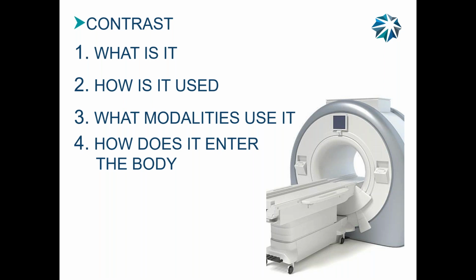And then what is the basic definition of contrast? I stand beside her. What is the difference between us? The major difference. Exactly. So contrast is the difference between black and white when it pertains to video.